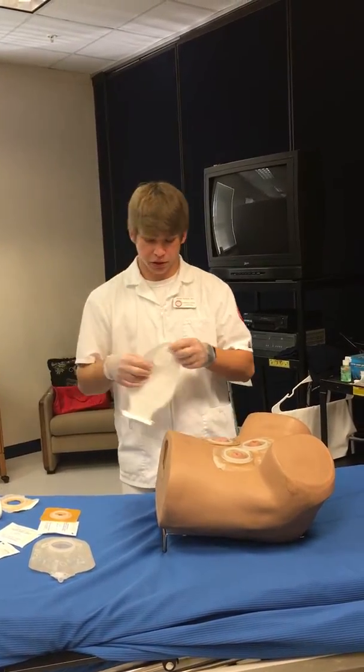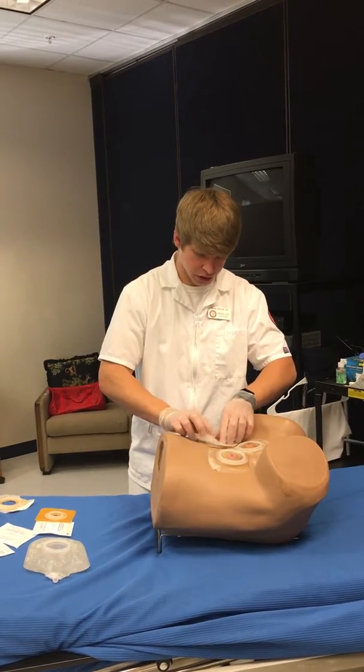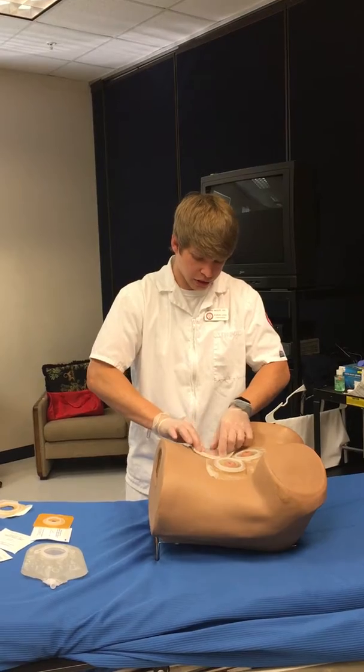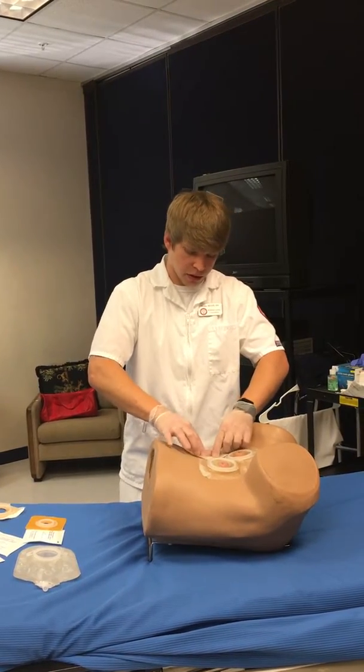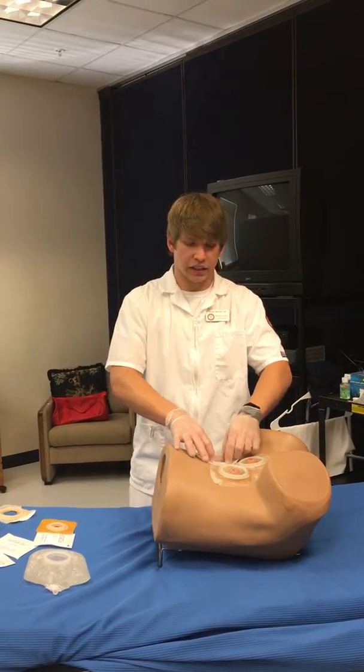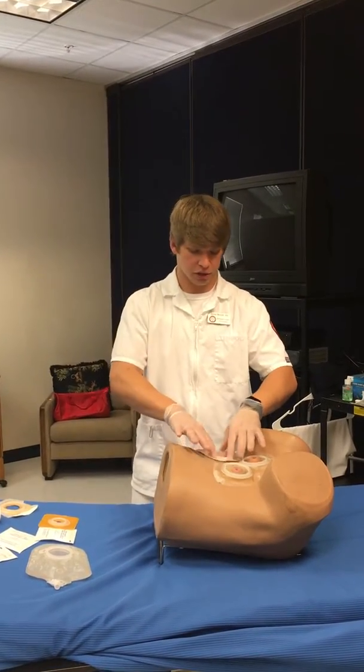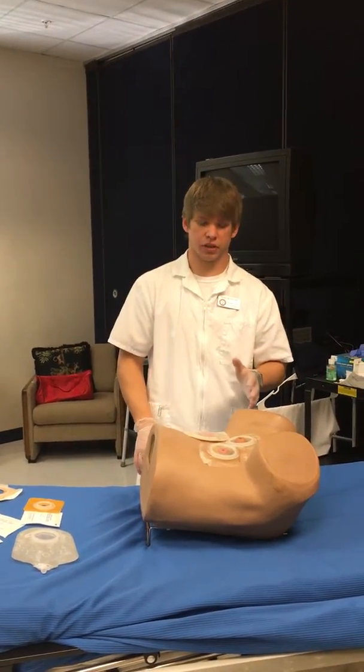After that, get your stoma bag and you'll hear it click. It's very important that you make sure this is secure — you can hear it clicking. Make sure it fits so nothing leaks out. After it fits and you get it on there good, check and make sure all your seals and everything are good to go.